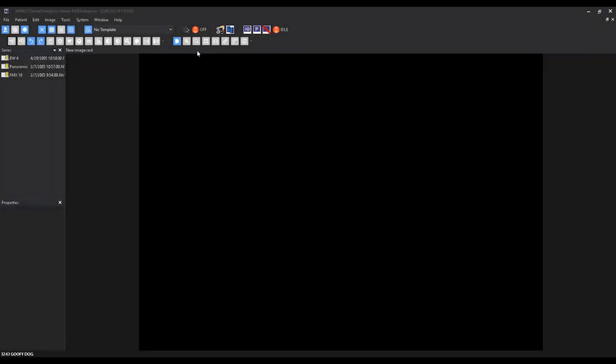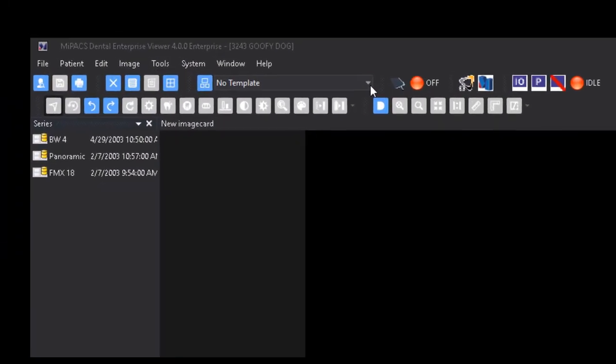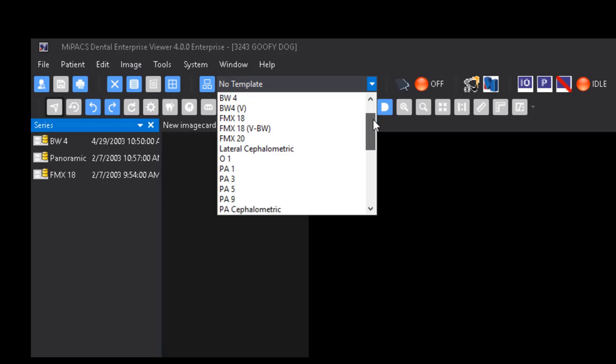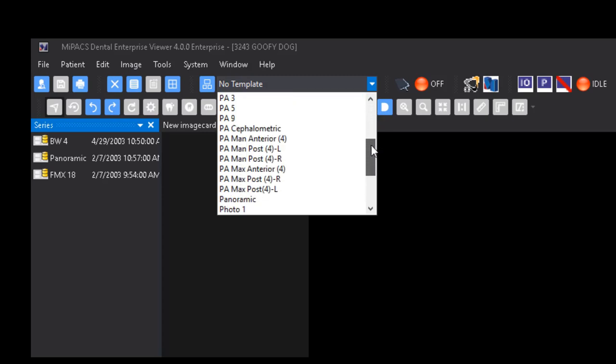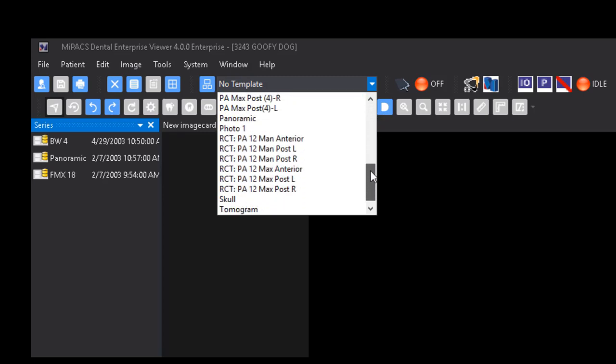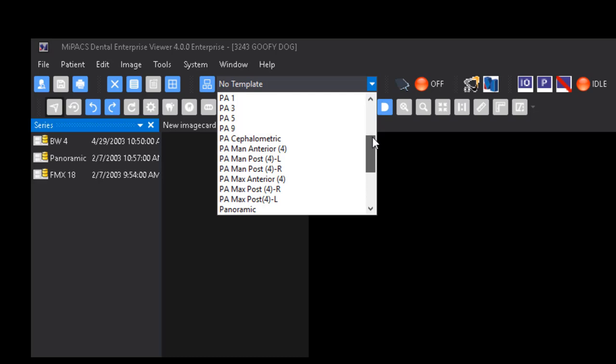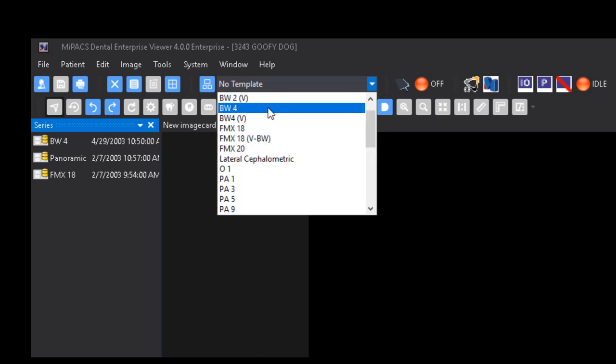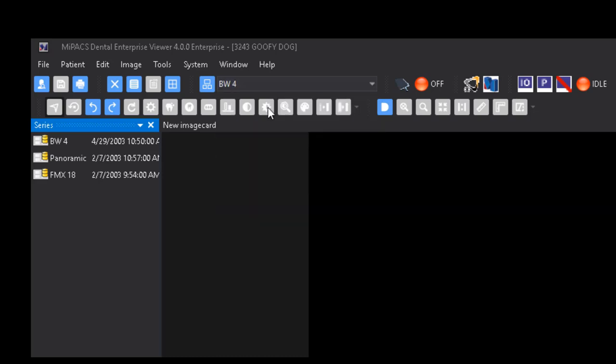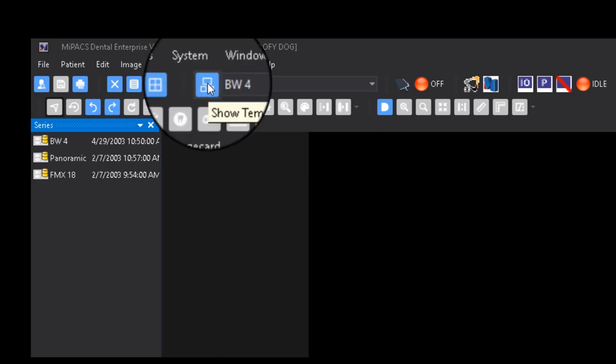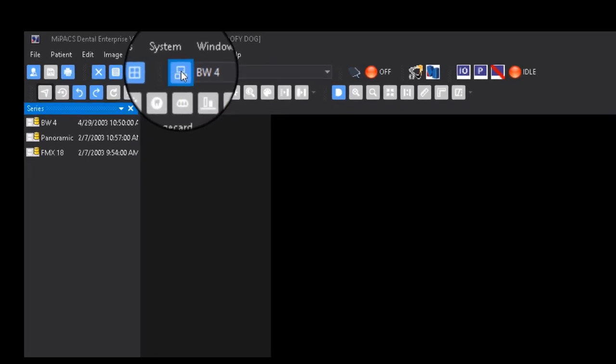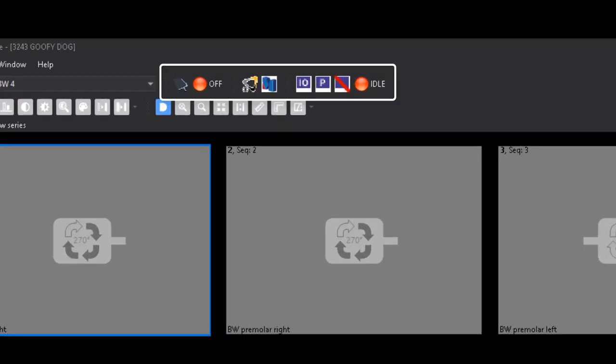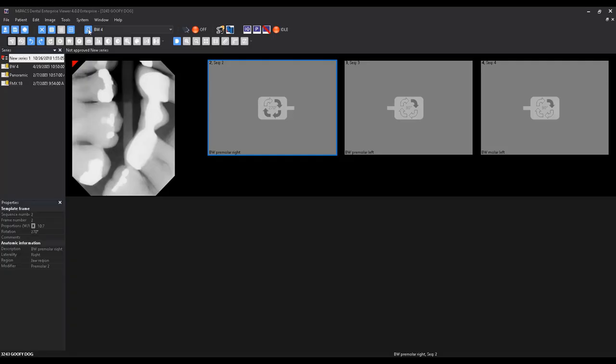Once a patient record is open and you're ready to capture images, you must first select a blank template. Select a template from the drop-down menu and click the Show Template button. Once the template appears on the screen, you may now activate the corresponding plug-in for the sensor you wish to take images with. The images will appear in the template frames in the order you capture them in.